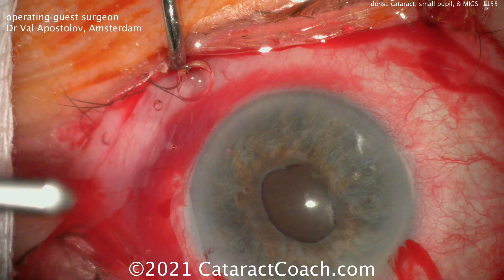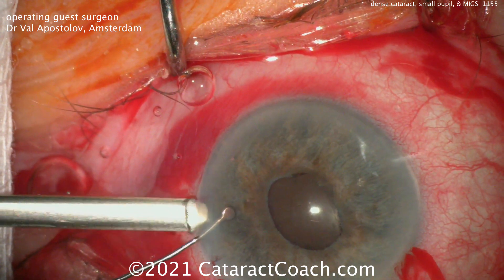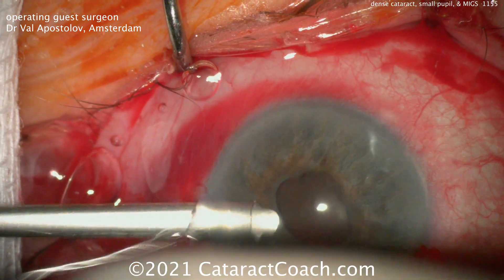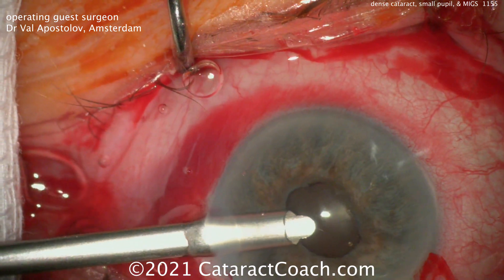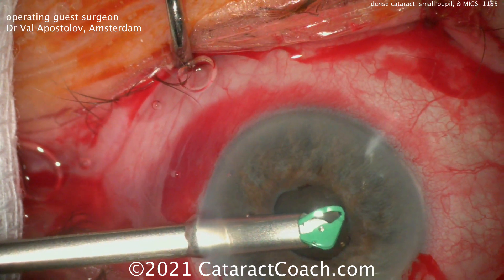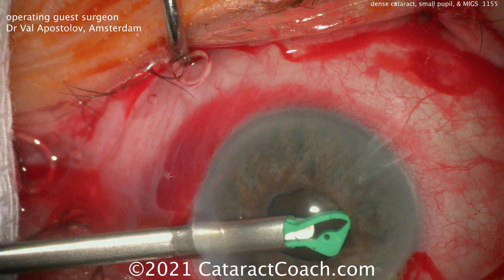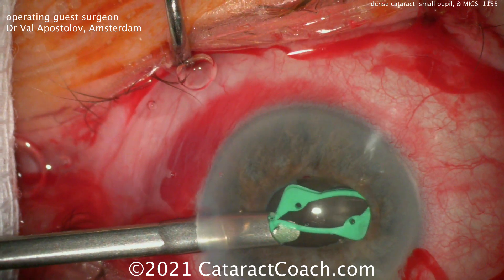Our guest surgeon is one of my favorite people to watch, and that's Dr. Val Apostolov from Amsterdam. You can see there is the patient. He's going to put in a pupil expansion ring. There are many different rings on the market, and I like to be able to show you all different kinds. So check this one out.